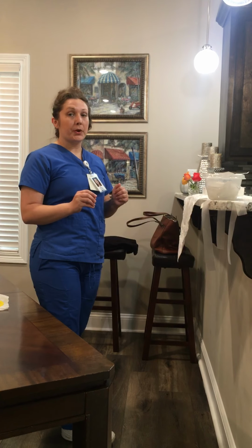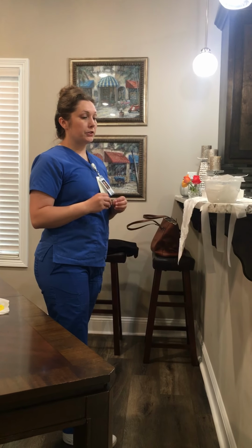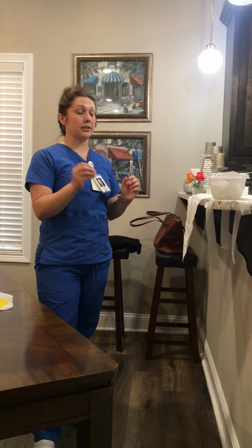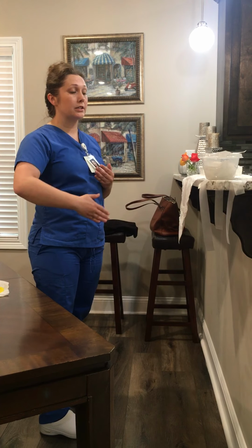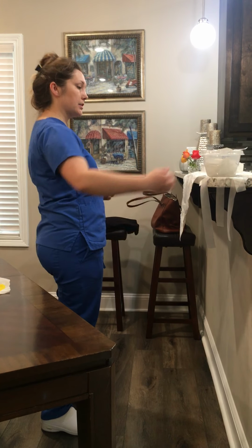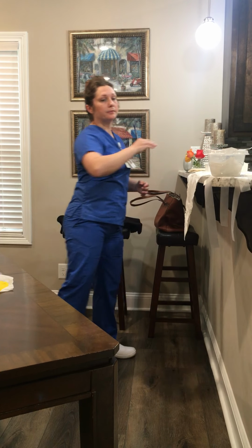At any point when you have a sterile field, you want to make sure that you're doing things to contaminate it as little as possible. But you are going to have to go in there and get things, and you are going to have to put things in there. So right now my sterile gloves are in there, so I do need to get them out, which is okay. I just need to enter at the least point of entry. So there's a little spot right here. I'm just going to slip my hand in and grab my gloves and put them on the side for now.